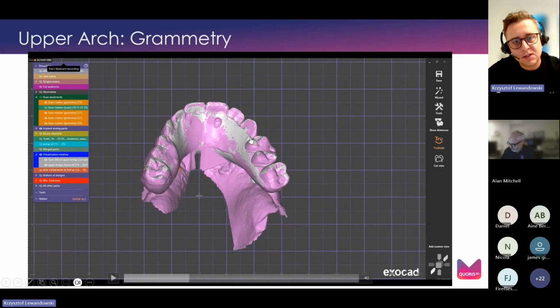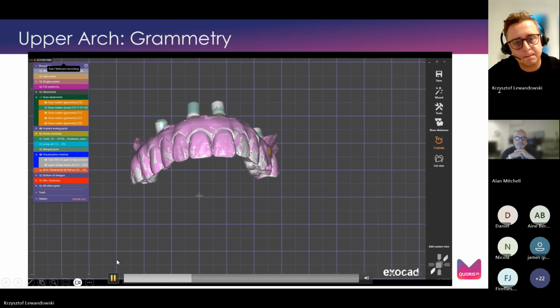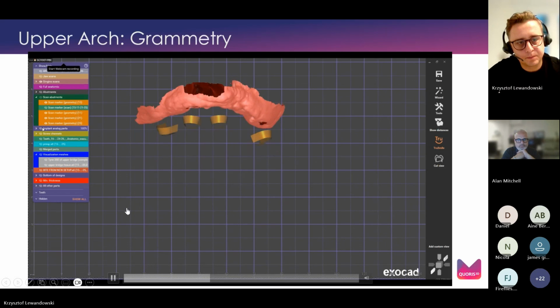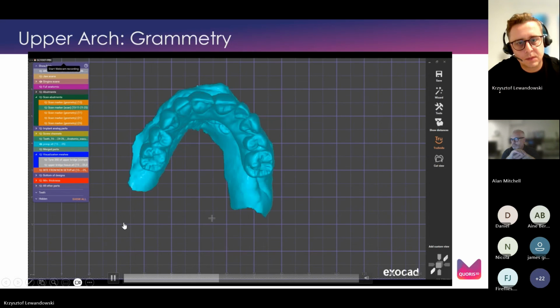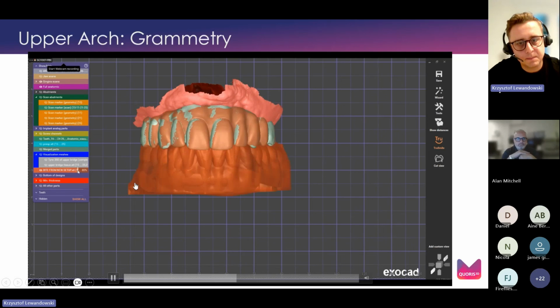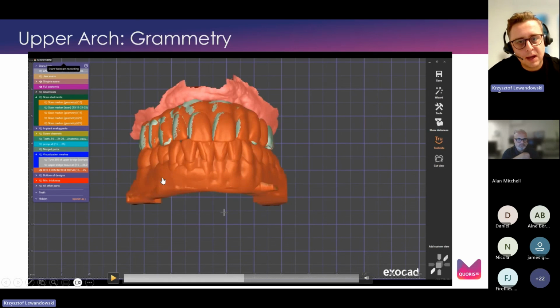Now we've implemented the in situ scan with the gingiva, and as I mentioned before, this scan helps us to position the gingiva scan correctly. Pre-op with the wax-up previously completed. New bite in situ scan. It's worth mentioning that in this project, our opposing will be the new lower wax-up.